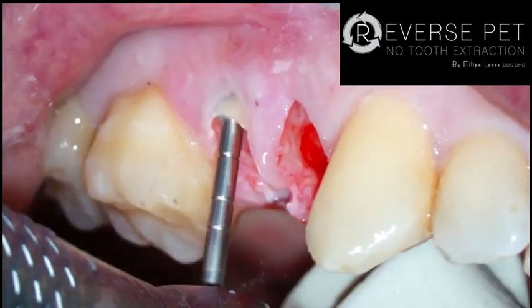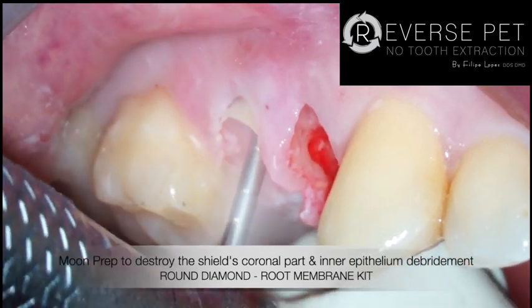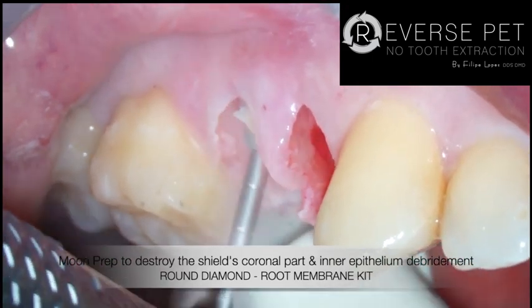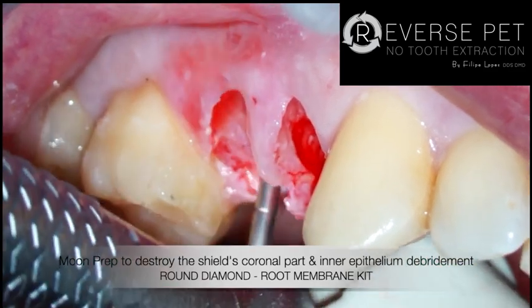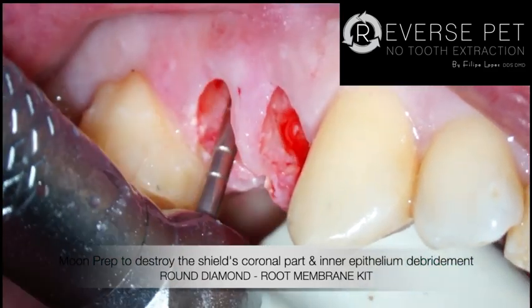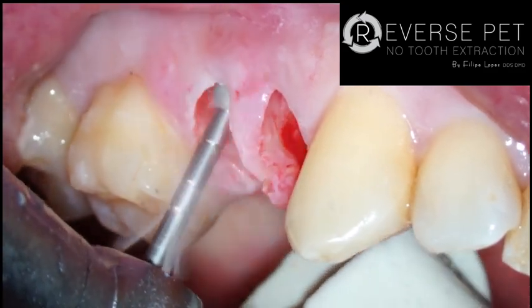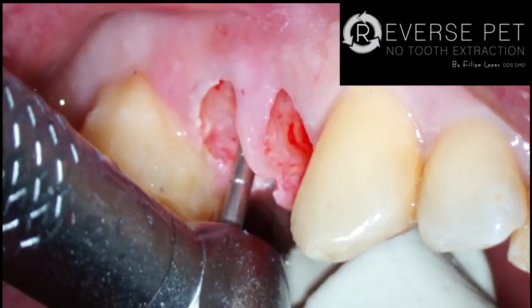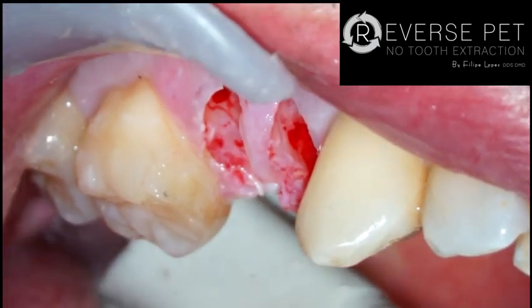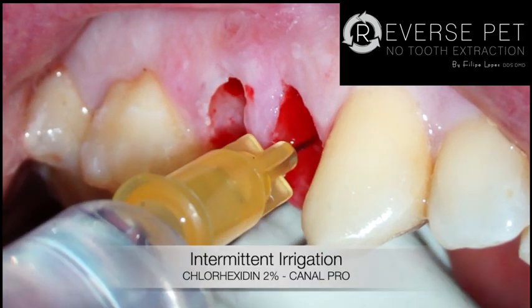because you want it to be bleeding. And I will explain that later, because you want it to be bleeding so that the attachment to the intermediate abutment you're using is going to be better. So because you will extend your implant, as you will see in a minute. So that's, we always irrigation, don't forget that.